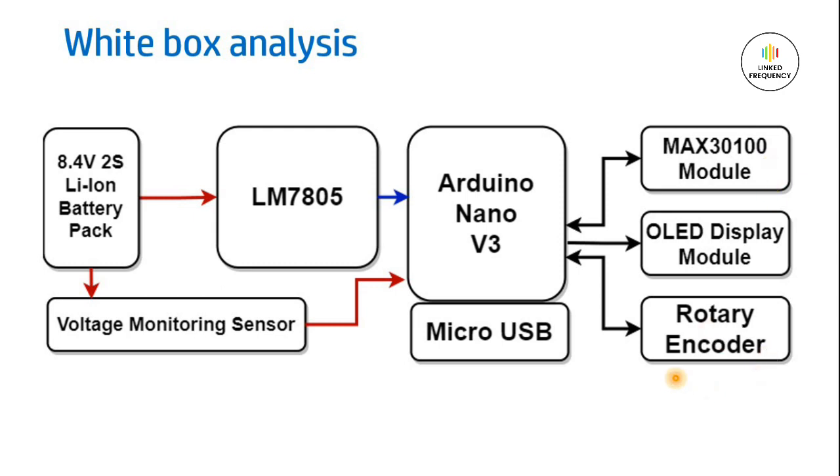Thereafter, for the user interface purpose, we are using a rotary encoder which comes with two important features. One is a rotating feature in clockwise and anti-clockwise direction. Along with that, it has an embedded switch for a click option. It's a kind of tactile switch. Whenever a user presses on that, you can create a menu on the OLED so that they can select a variety of functions and operate with that.